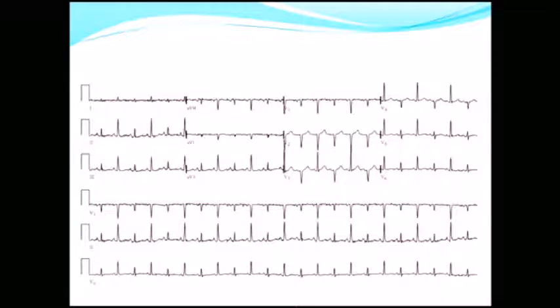Okay? Now, can anyone tell me, or the person next, don't tell me exactly what's wrong, but why is this ECG different to a normal ECG? Good. So it's not really taller than the other one, it's just alternating. Okay? So can you think of why this might be?